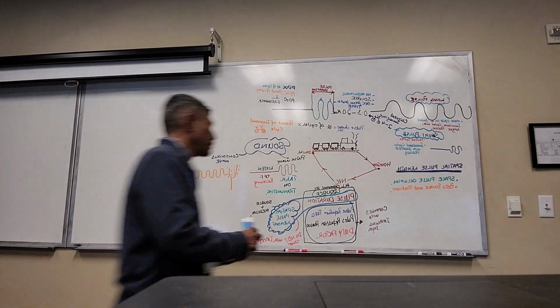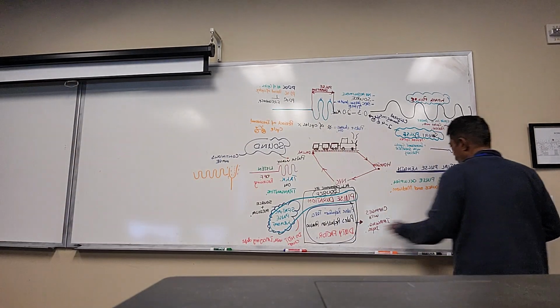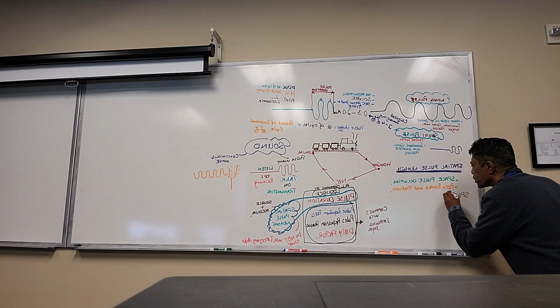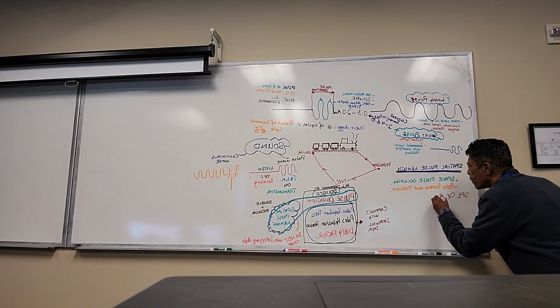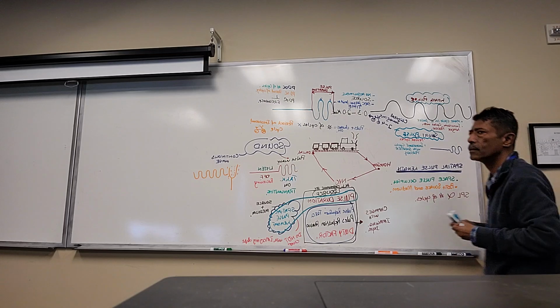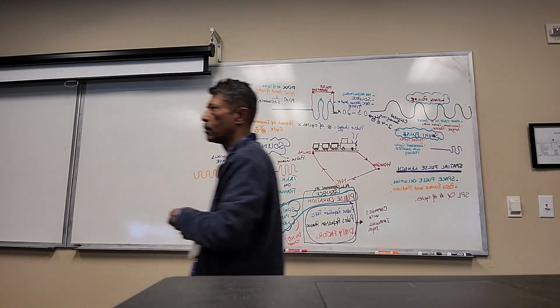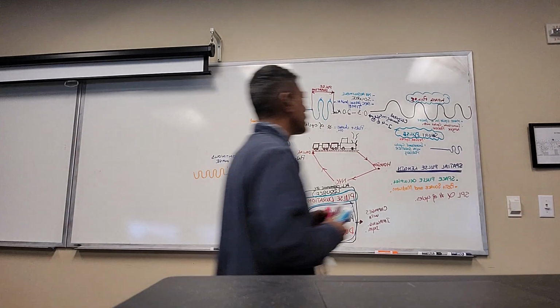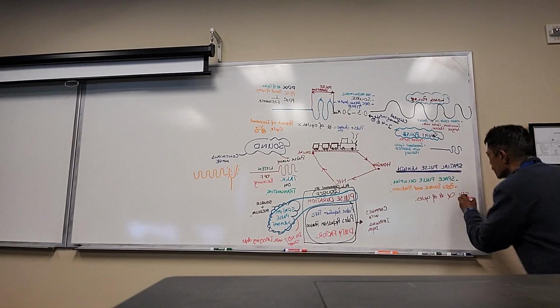Let me write that down. So SPL, spatial pulse length, is directly proportional to the number of cycles. Okay. What else? Then SPL is directly proportional to the wavelength of these cycles.